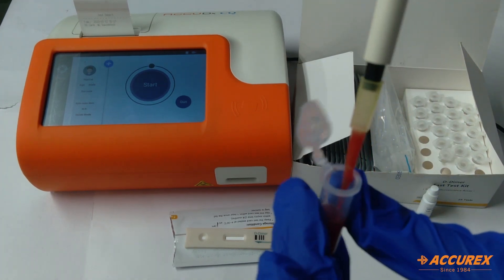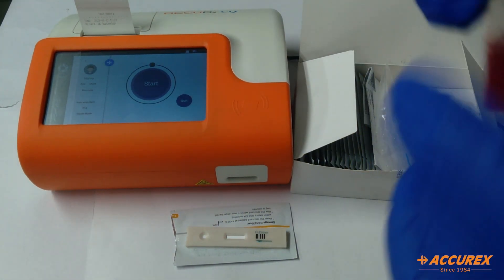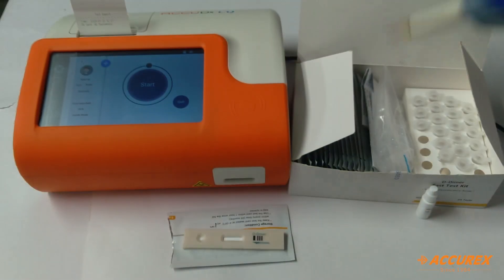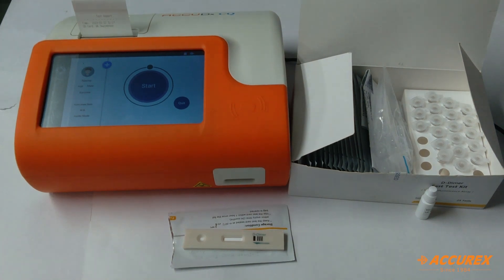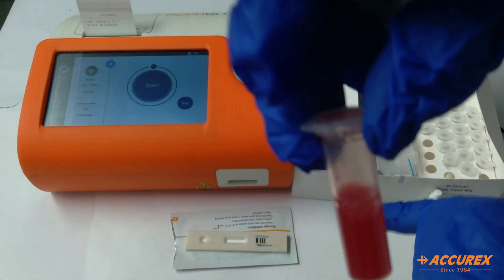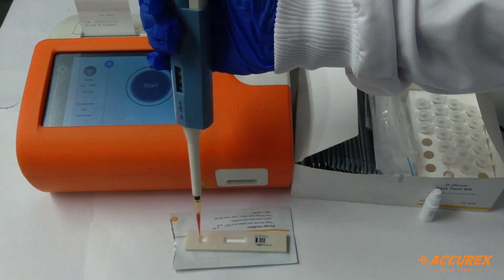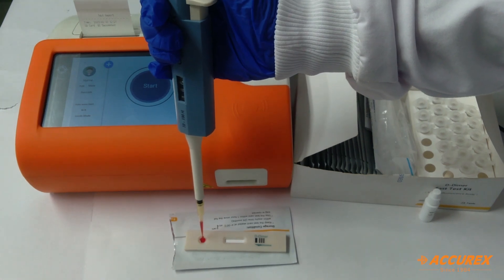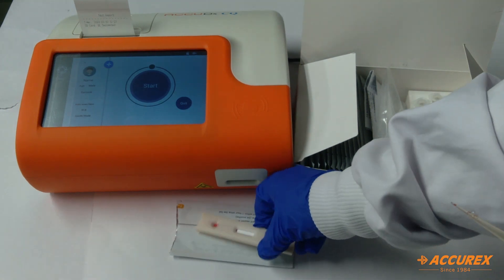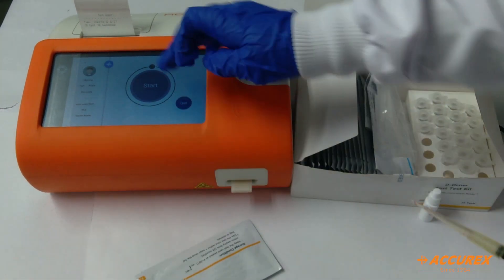We'll gently mix it. Now from this solution we'll take 100 µL and pour it into the kit. We'll insert the test strip like this over here and click on start.